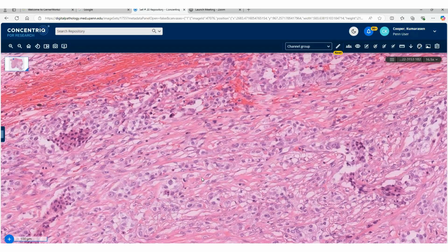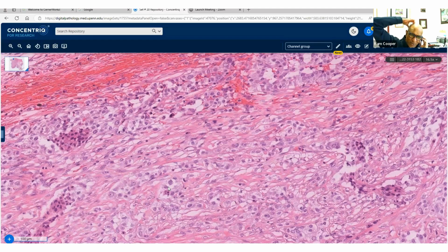So yes, Tom says he'll start with a nested epithelioid neoplasm consideration for a GNET or epithelioid GIST or neuroendocrine. Someone else, Dina, has suggested alveolar rhabdomyosarcoma. So those are the suggestions we've got thus far. Okay, wonderful. That's a great start. Having ruled out epithelial, that's an excellent differential diagnosis there.